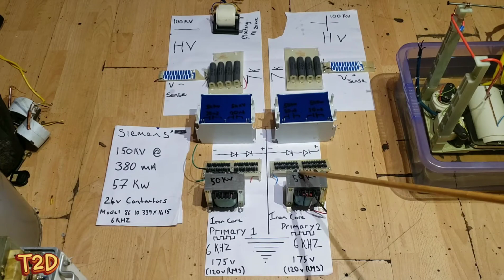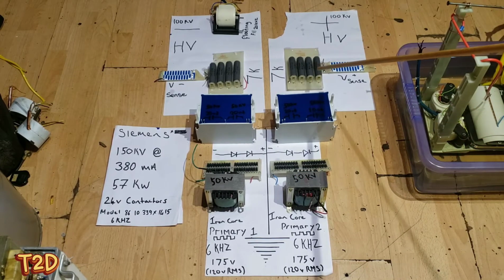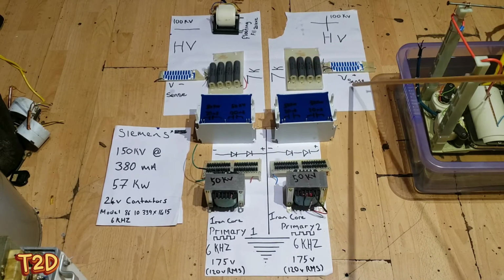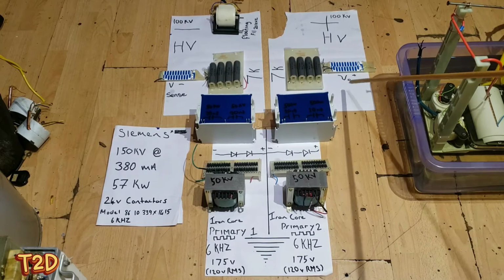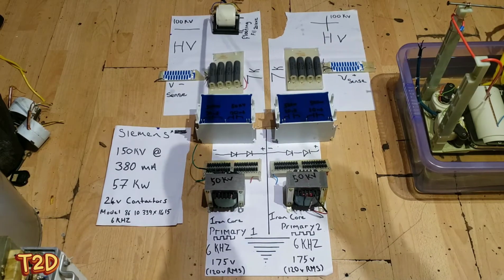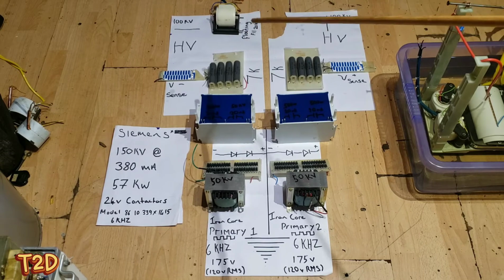So we have transformer, voltage doubler, and we have a series limiting resistor. This is a 7k resistor, again on both sides, and then we have a resistor for sensing the output voltage. And lastly, we have a filament transformer over here, which is floating, so it has to be insulated up to the full voltage of one side. That's why it's under oil.